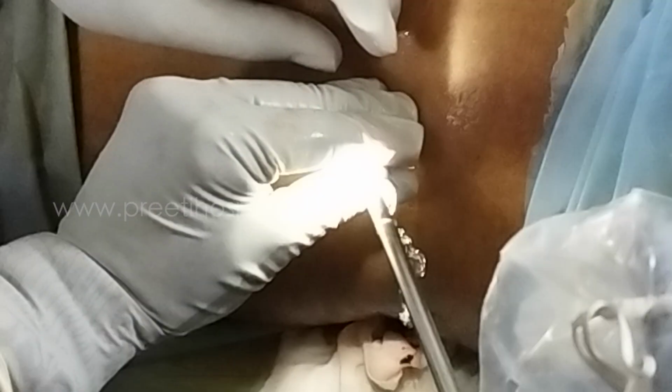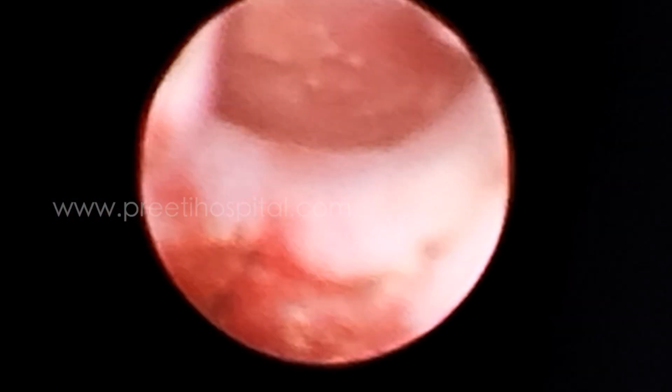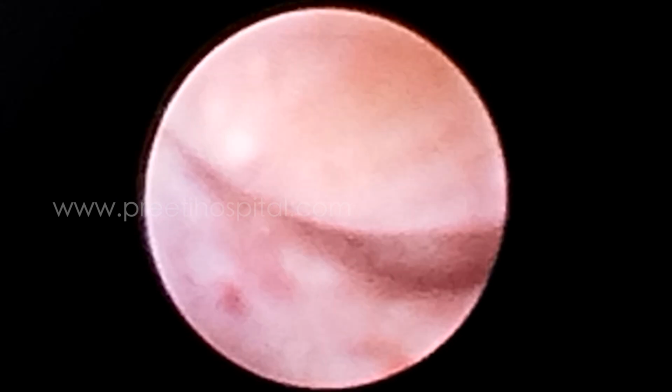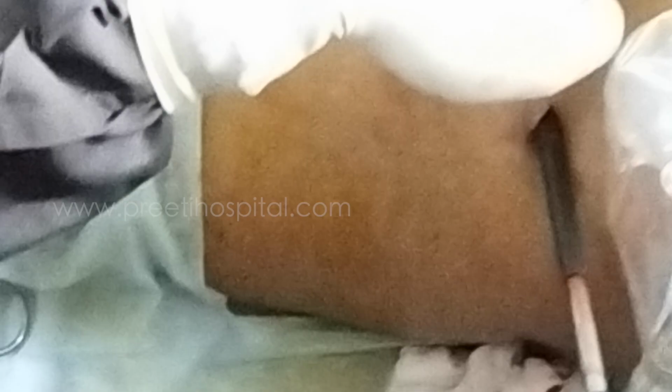Now I am sucking out. Flush. See again and again. This is middle calyx or not? Middle calyx is also down, posterior to the inferior calyx, not the posterior calyx. This is the inferior calyx actually. Now inferior calyx, any other part if you want to see, this is the anterior inferior calyx. This we could not delineate. This calyx we could not see. You are looking up here. Yes, sir. The inferior up calyx.